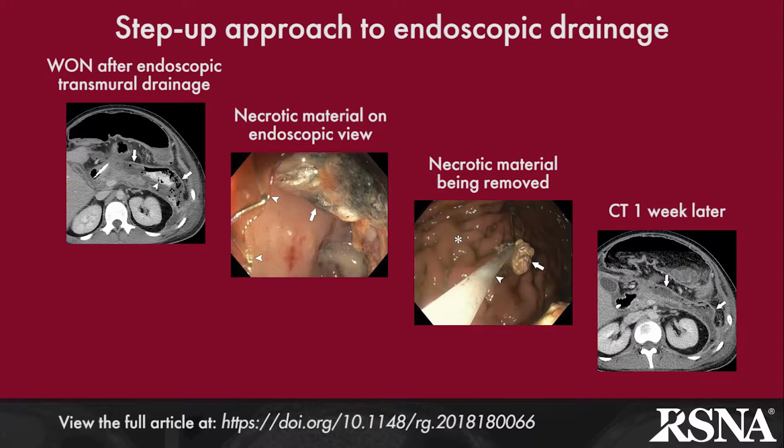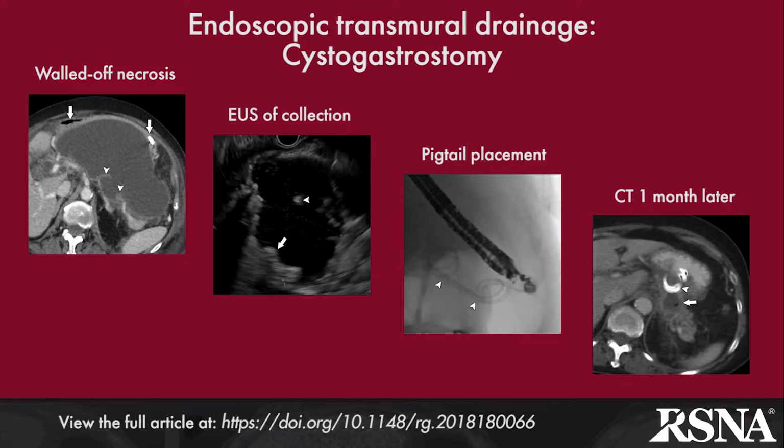An important principle in the modern management of pancreatic fluid collections is the step-up approach, in which minimally invasive techniques are used initially, with definitive necrosectomy either delayed or avoided altogether if possible. The authors illustrate the use of cystogastrostomy and cystoduodenostomy for fluid collection management.